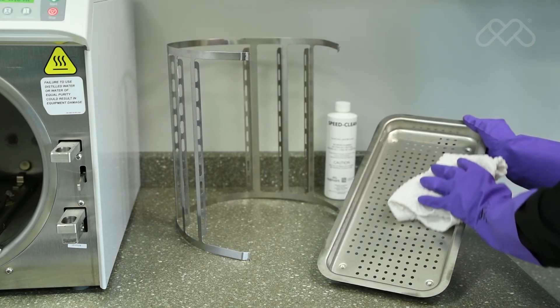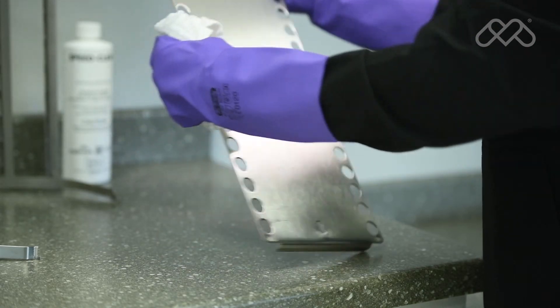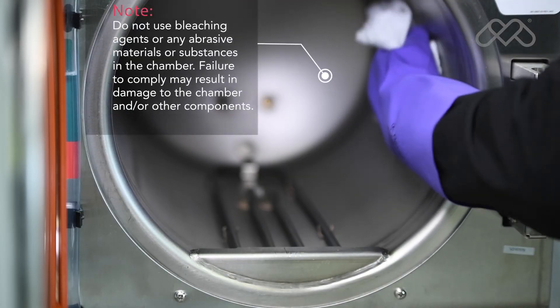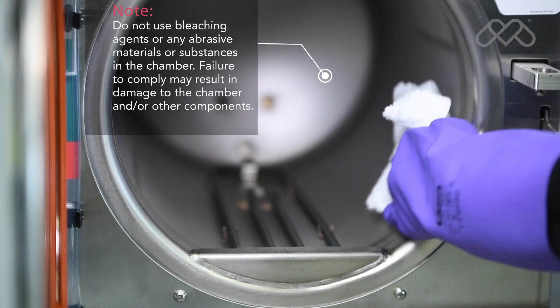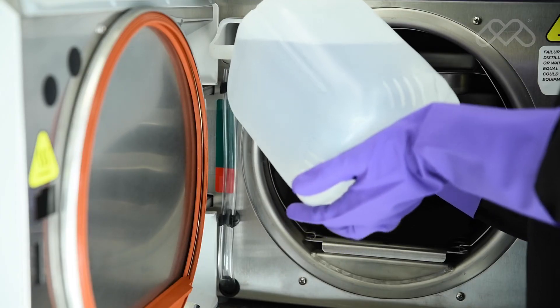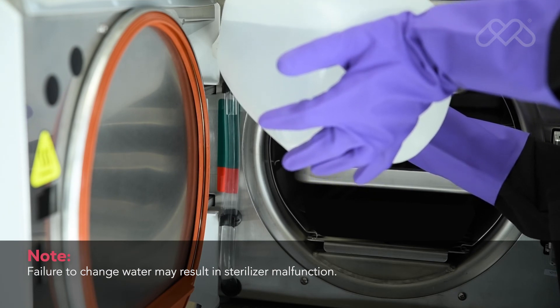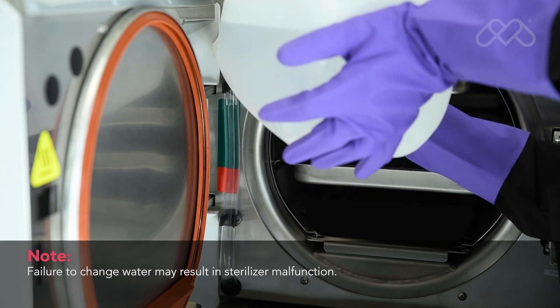Wash the trays, rack, plate, and inside of the chamber with mild detergent or speed clean and distilled water that meets the referenced water purity specifications in the user guide. Refill the reservoir with distilled water or other purified water that meets the referenced water purity specifications in the user guide.